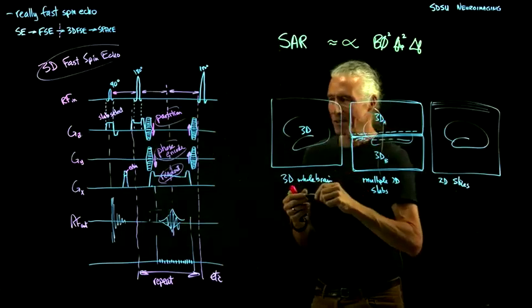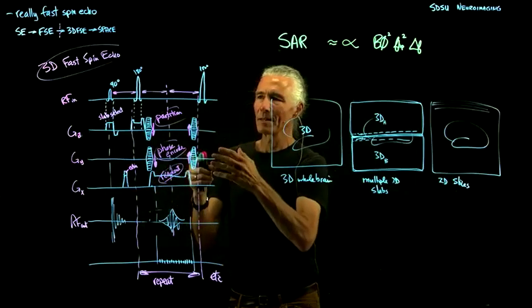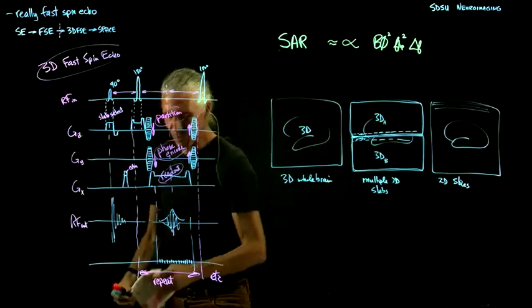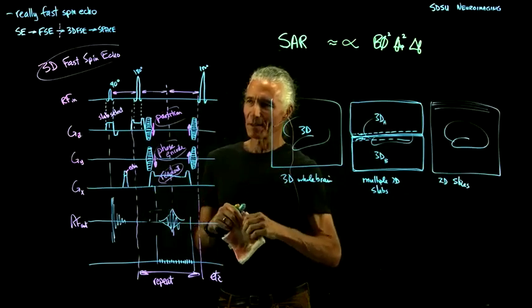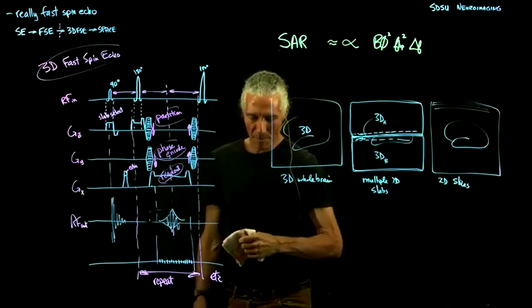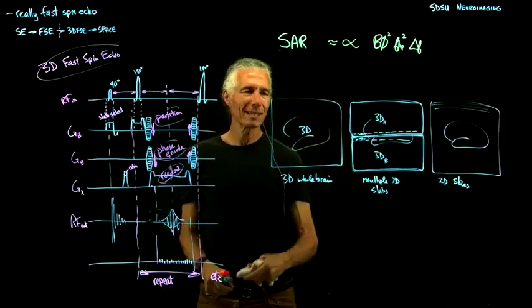And so this sequence was around for quite a while. In the 90s already, we had this sequence. I used it once on a preserved dolphin brain. If you go to the MRI center, you can see a reconstruction of the dolphin cortex using a sequence like this. But it never got really popular. It's just for clinical use, because it's always a little fiddly.